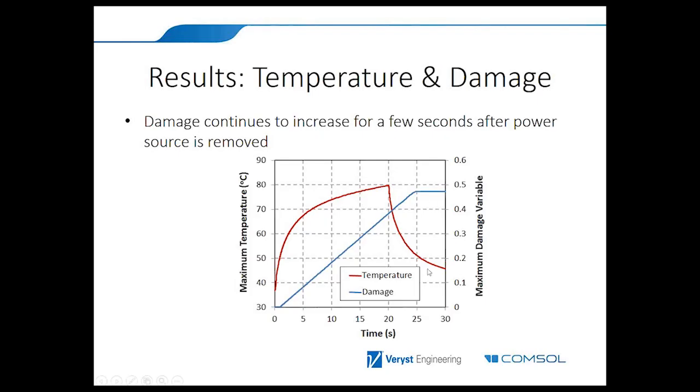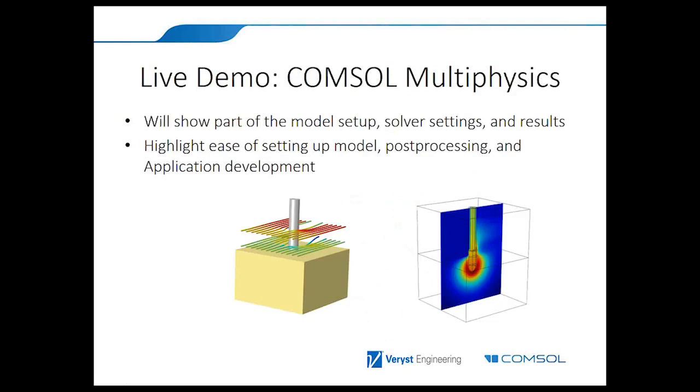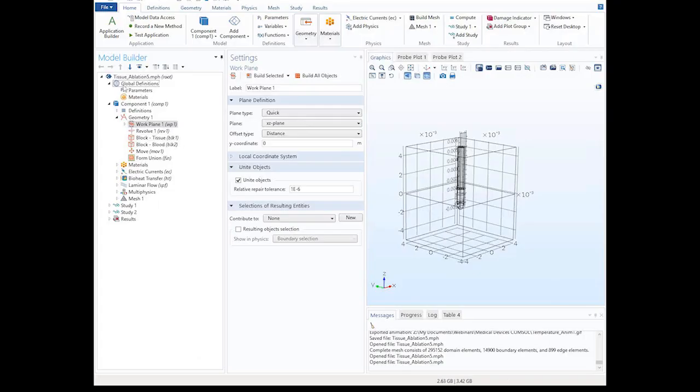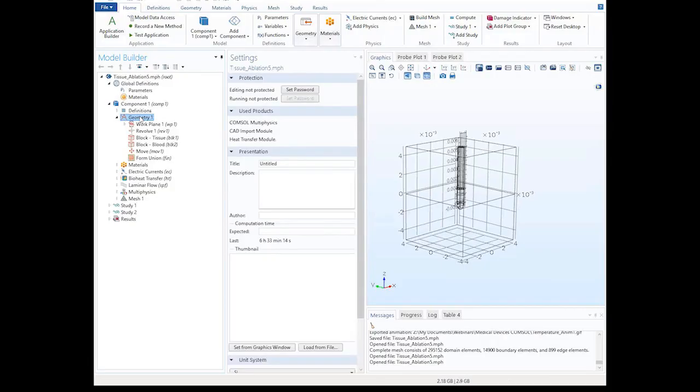Okay, so time for the live demo. It's a big model, so I'll try to just show the part that shows how to set up the model, how to get the results, how to post-process, and how to develop applications, because it's really straightforward. So now I'm going to switch over to COMSOL. Okay, so there is the model. So the geometry, let's start with the geometry.